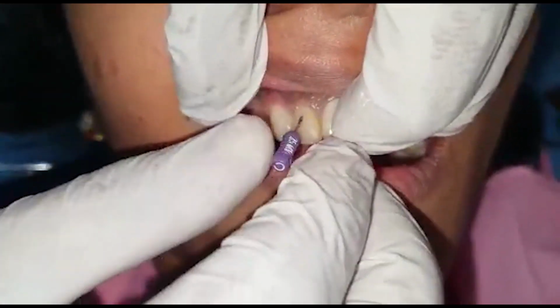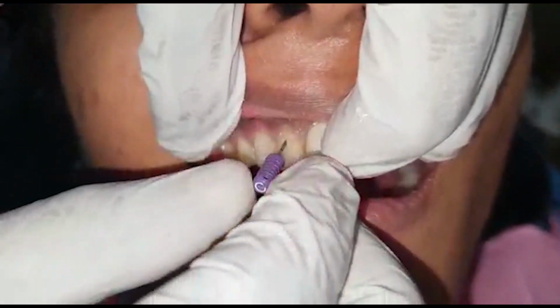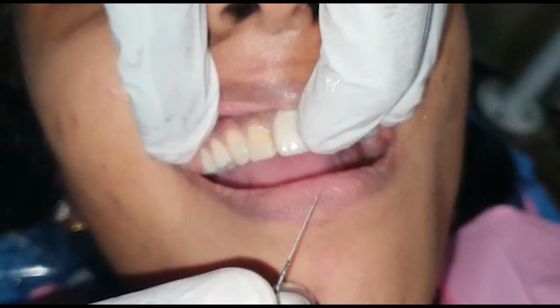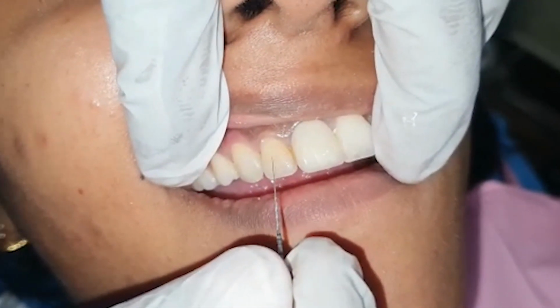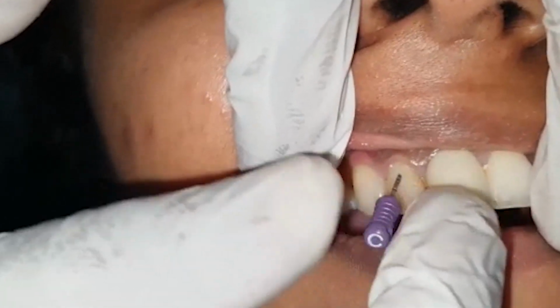Always keep in mind to use a smaller length file initially, and once you have started moving in, then you can use copious amounts of EDTA and you can use a larger size file, rather longer files. Now I have almost reached the curvature. You can see that I have not engaged the curve. Now I am placing it back again. Probably I have changed to a newer file.